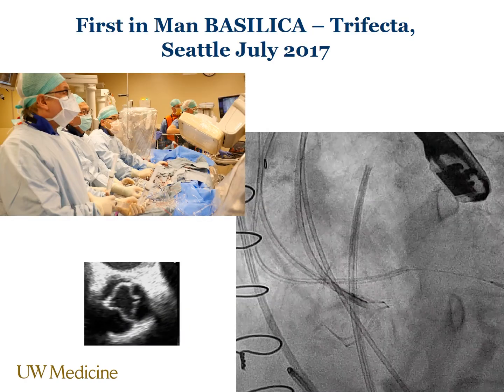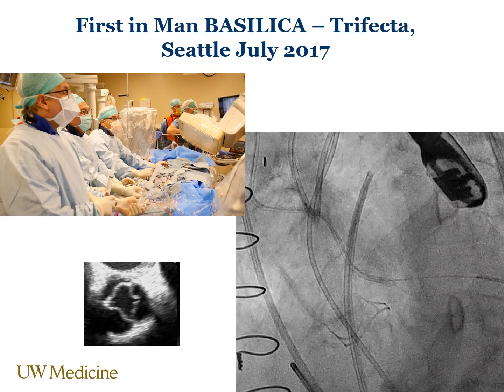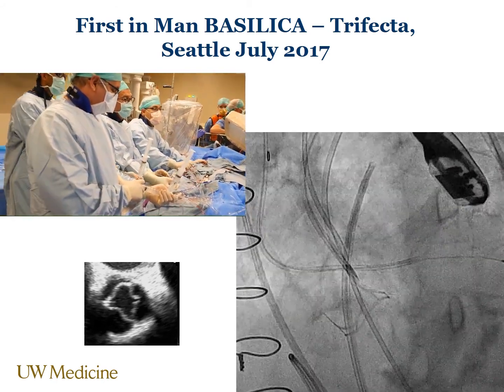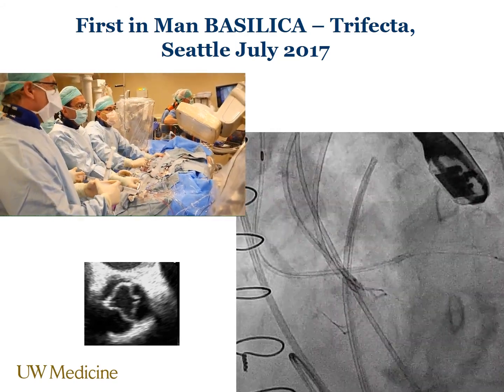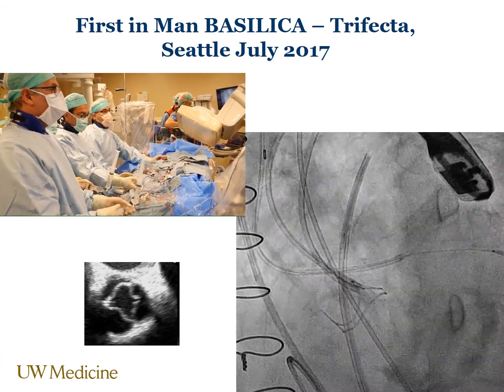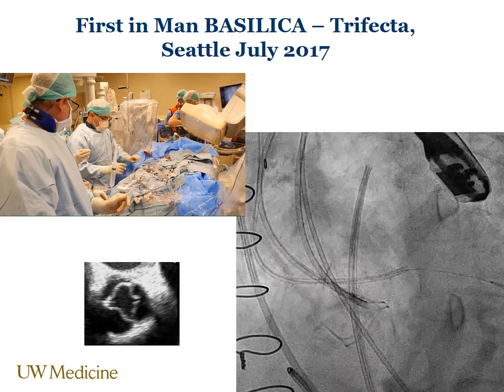The first in-man Basilica, I'm proud to say, was performed in Seattle in July of 2017. It was really guided by my partner, Danny DeVere, and you see in the image Dr. Gabriel Aldea as well. And the idea, again, is a laceration of the leaflet that's in front of the coronary artery, thus allowing flow into the coronary artery.